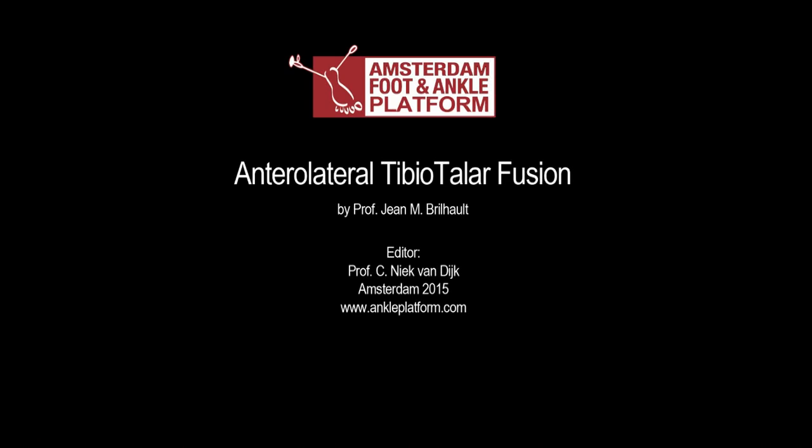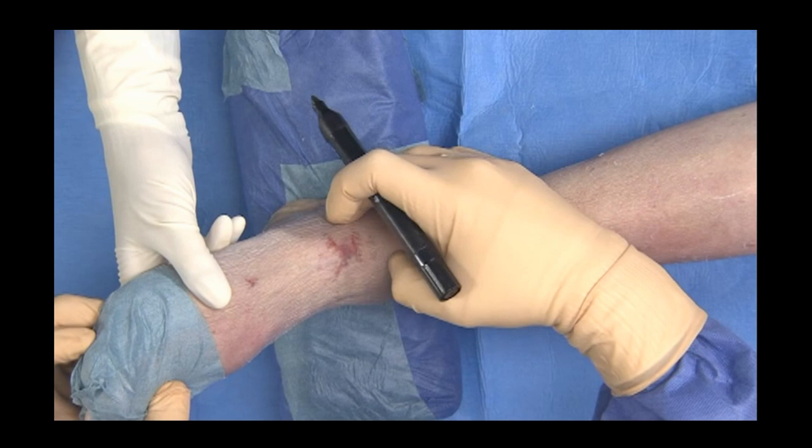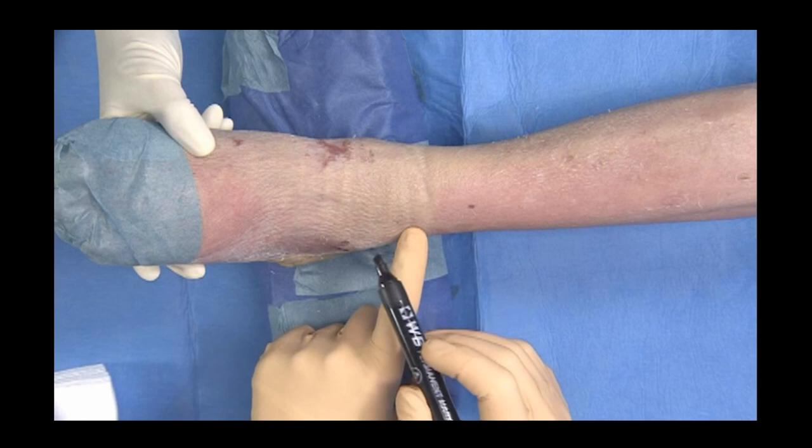An ankle fusion is illustrated here through an anterolateral approach. The skin incision, which is centered at the ankle joint, runs parallel to the fourth metatarsal distally and runs between the tibia and the fibula proximally.